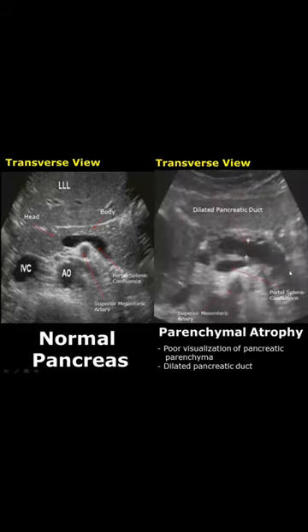Chronic pancreatitis may lead to atrophy of pancreatic parenchyma. We do not see much of the parenchyma of the pancreas — we don't really see the body or the head as much as we should.